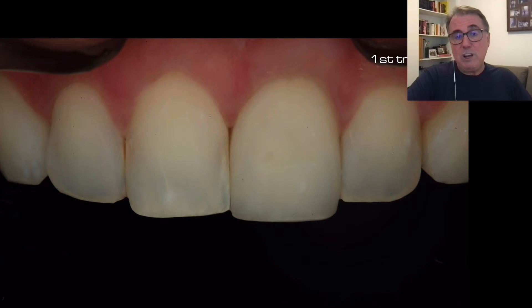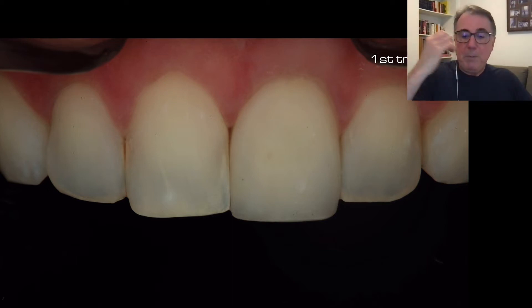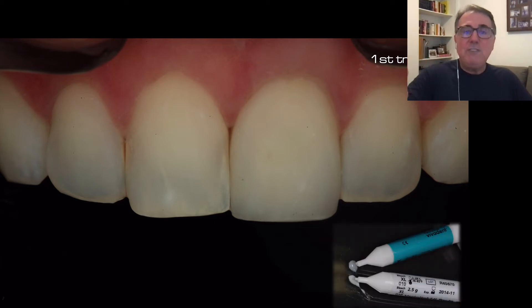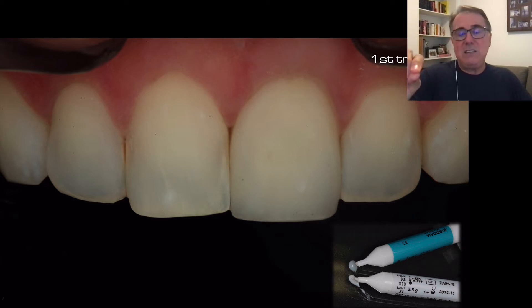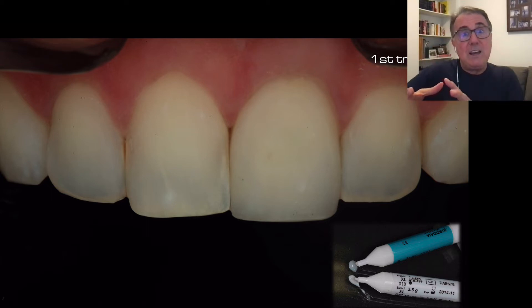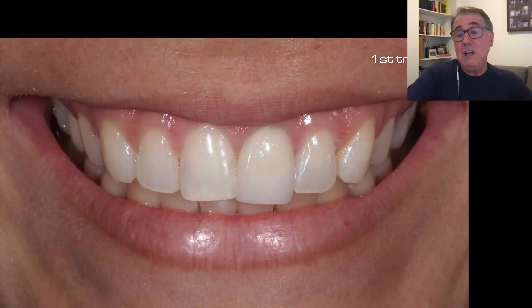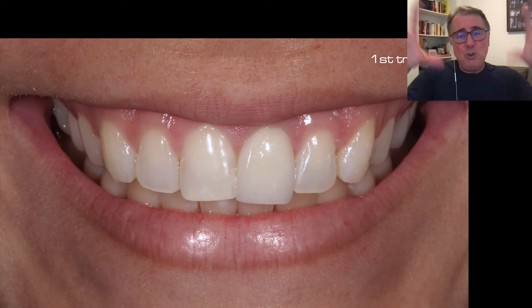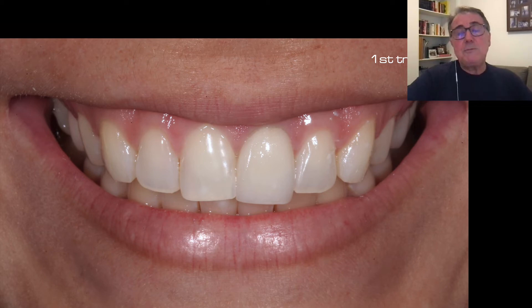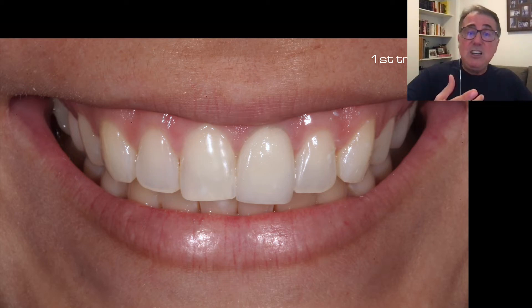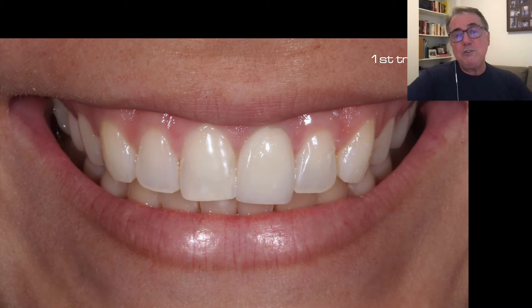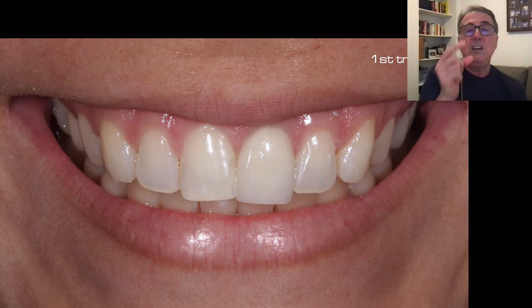On the next appointment, this is the first trial from the first veneer the technician made. It didn't look good to me — here it is on the polarized filter picture. We need trying pastes with different opacities: very opaque and medium opaque. The incisal edge had too low a value, too gray, and didn't match well. This is a feldspathic veneer — we find that if the technician has the proper skill to build a feldspathic veneer, we get a better result in dark tooth cases.